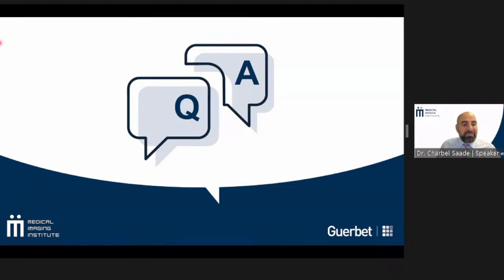Anonymous attendee, do you recommend a post-examination scout image to ensure the catheter is still in place post-scan? Anonymous, thank you so much. Normally, you would actually see this on the scan itself, because most of the time it's a chest CT. And if it's abdominal, you can still see it on the scanogram, but usually it's fine because you'll know the position with the hand raised. Joson Ayusu, does the CT scan slice affect the flow rate? Well, in this day and age, anything above 16 slice CT scanners, there's no effect at all. Anything below that, yes, there is an effect. So if I was to do a CTPA on a 4 slice or a 16, I'd only get 3.5 mils a second only.